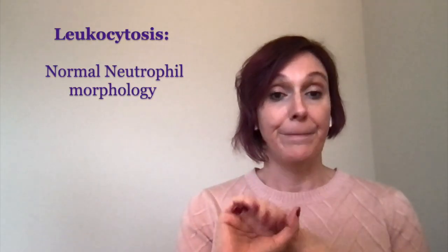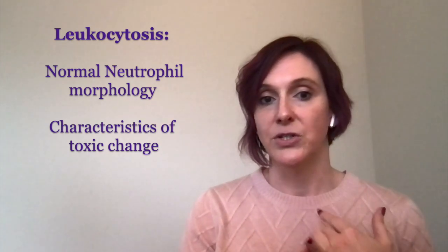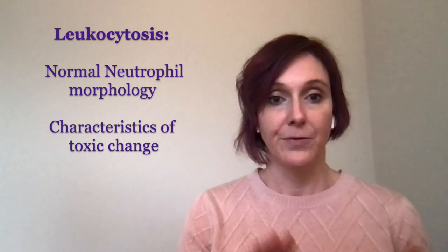So there we go. Let's wrap up our white blood cells. What have we reviewed today? So we've reviewed neutrophil morphology. We've talked about bands and metamyelocytes. And we've talked about how when inflammation is more acute and driving that white blood cell response, they can sometimes have evidence of toxic change, increase in Döhle bodies, basophilia, foamy cytoplasm.